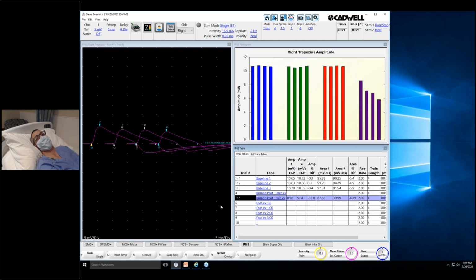Okay. And then a question on electrodes again. Have you ever used sticky electrodes for better stabilization of the stim electrode? Put stickers to stimulate? I feel like that would still be really hard. The biggest thing is we make sure the patient doesn't move their neck or their face at all. They don't move their head, because the skin can move over the muscles and the tendons and the nerves. So if you've got electrodes just floating on the skin, they can easily move.